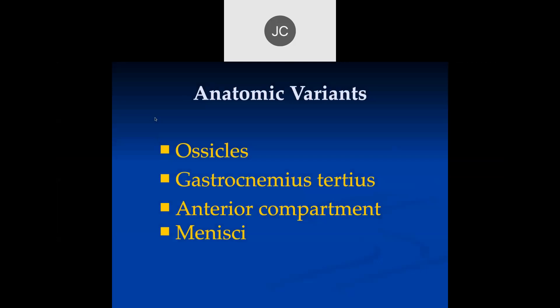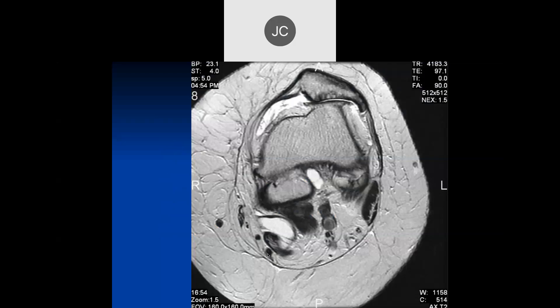Let's continue with MR of the knee. We're talking now about anatomic variance. We'll talk about ossicles around the knee, some muscle variance in the anterior compartment, and some of the menisci.